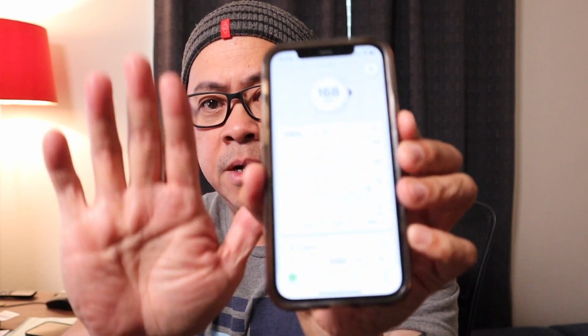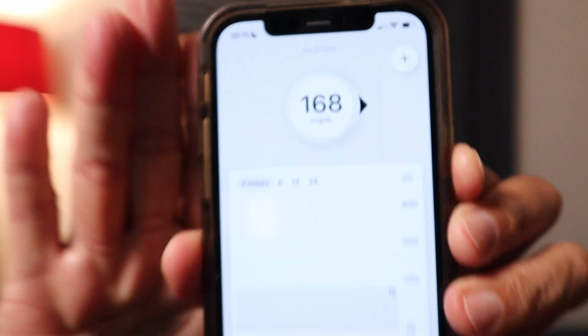Usually it doesn't happen with the G6. So I spoke to DEXCOM support, and as I said, they are sending a replacement. It's just a pain that I have to go through all that, moving from this arm to this arm, and I'm happy to report that it seems to be working. I'm getting the reading. I just had breakfast, and there are no alarms or anything like that yet.